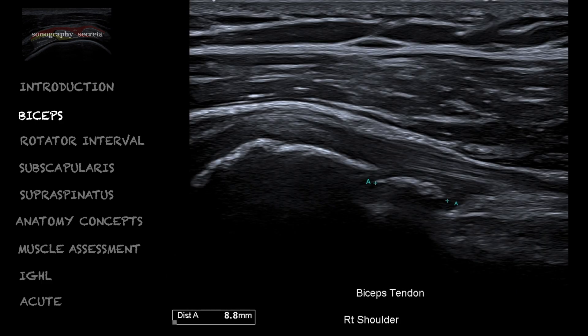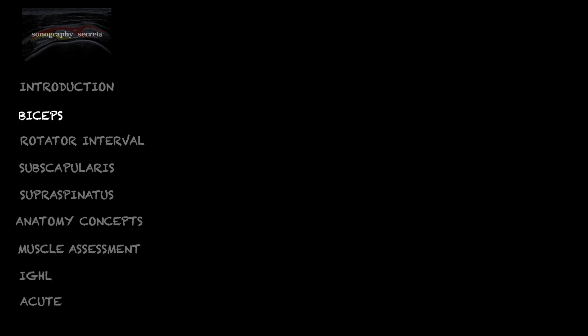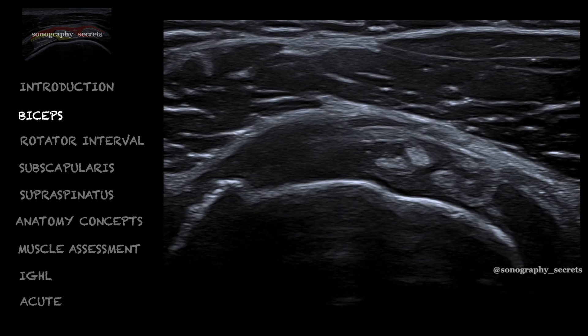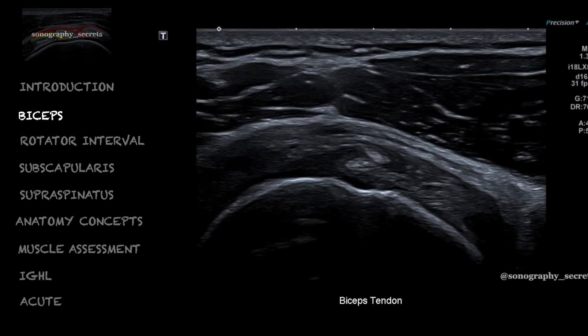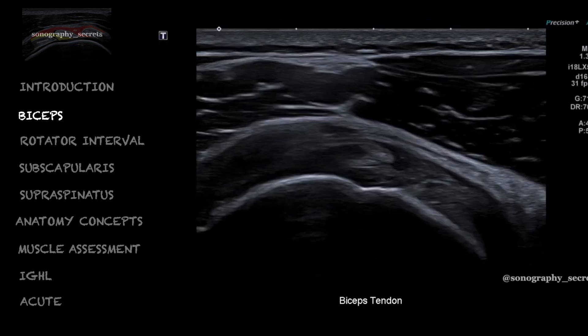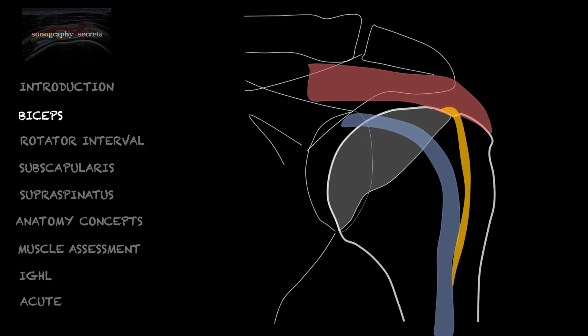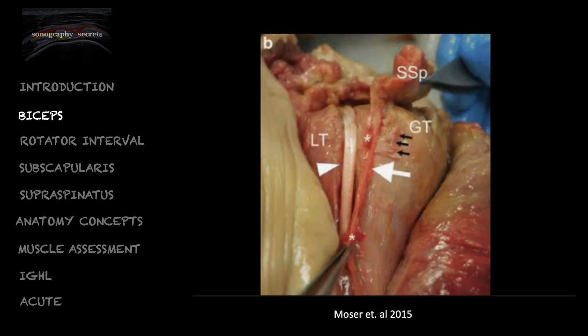Calcified loose bodies are often seen within the biceps sheath, suggesting a degree of glenohumeral joint osteoarthritis. In this case, it appears as if we have a bifid biceps tendon; however, this is not a bifid biceps tendon but instead the aponeurotic expansion of supraspinatus, as depicted in yellow on this schematic and in this cadaver image from Moser.